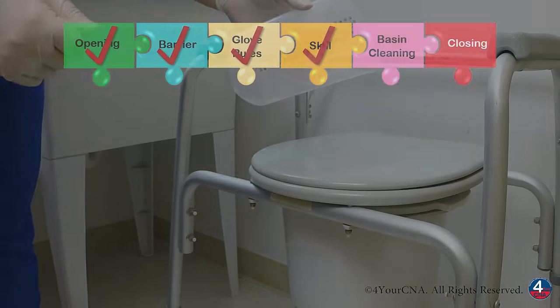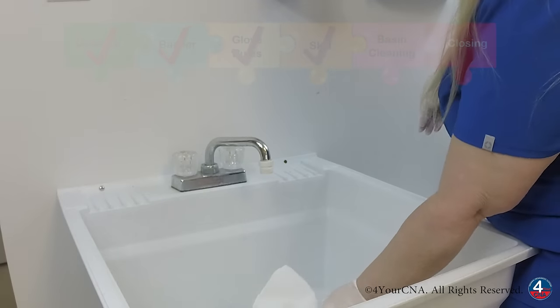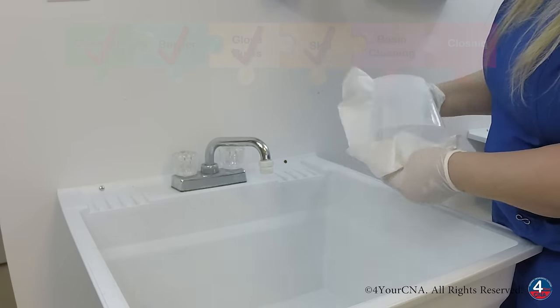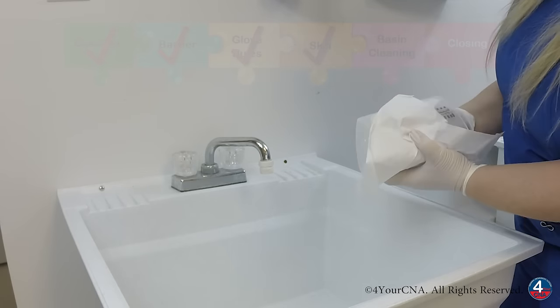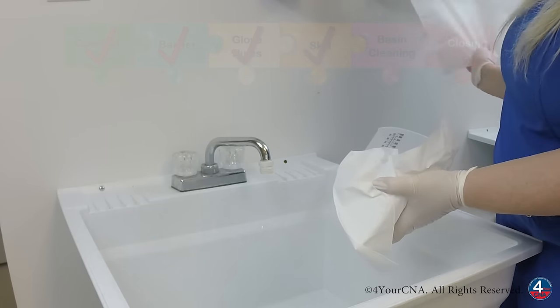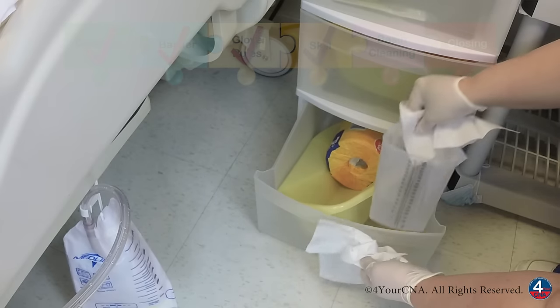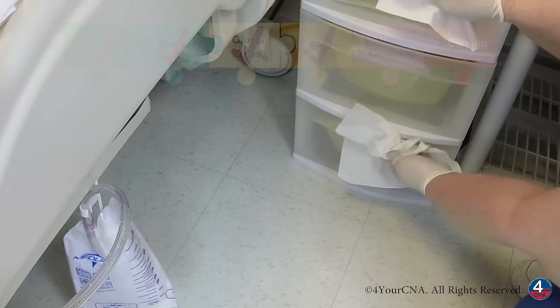Now we can clean. After dumping the rinse water into the toilet, we'll set it down, use a paper towel to pick it up, a paper towel to dry the outside, a paper towel to dry the inside, and we'll discard this, and then one for the drawer. We're going to place the graduate container in the bottom drawer and close the drawer with a paper towel.